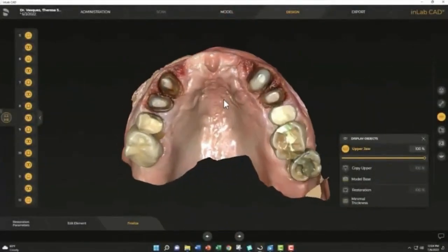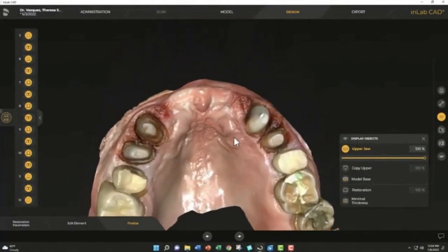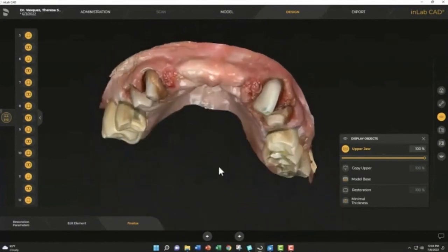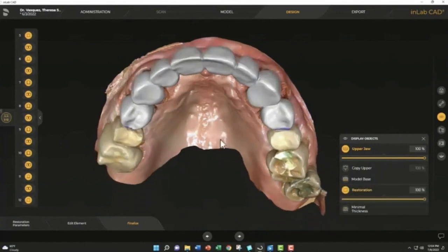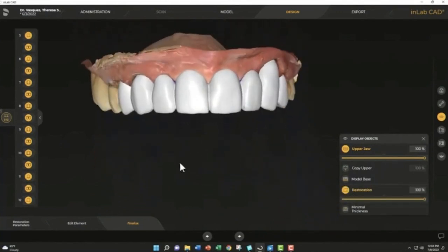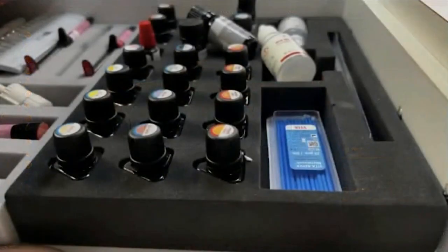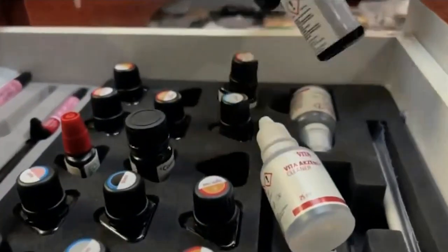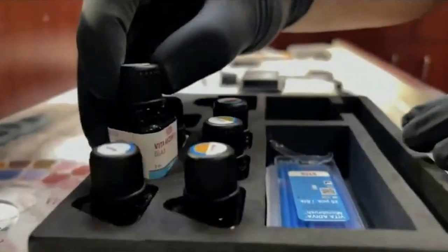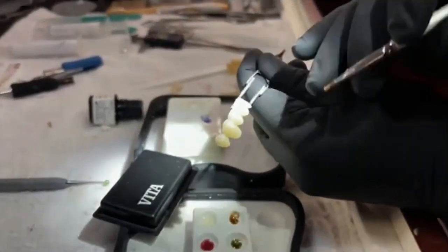Okay, let's keep going with printing restorations. This is literally an 8-unit bridge. The soft tissue is completely bad. She had an existing bridge where teeth were full of decay, so we were able to restore them. We designed it, and in this case we print these restorations, and the next thing is we have to make them look good, because the printed restorations are monochromatic, so they're only one color. We have good stain and glaze kits right now, like the Vita Accent LC.